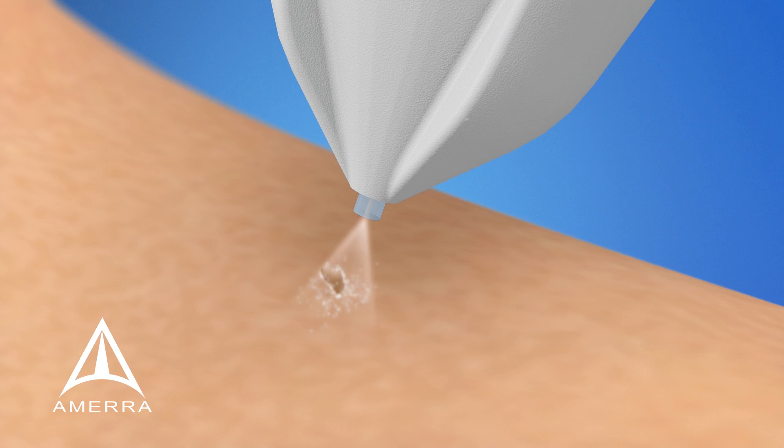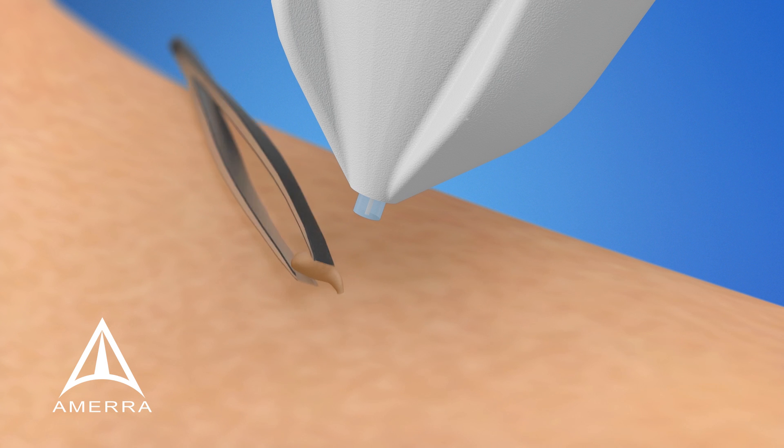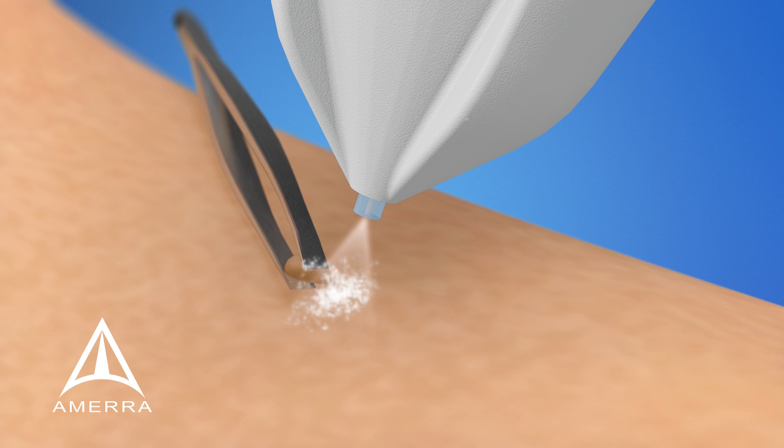To achieve optimal results with skin tags, we recommend treating the base of the skin tag for 5 seconds. If the skin tag is large or has a thick stock, use tweezers to bend the skin tag over so you can treat the base. We recommend two, 5-second treatments spaced 5 seconds apart for larger skin tags.